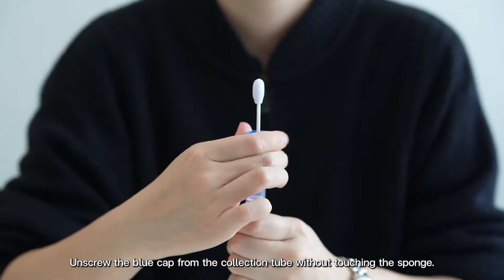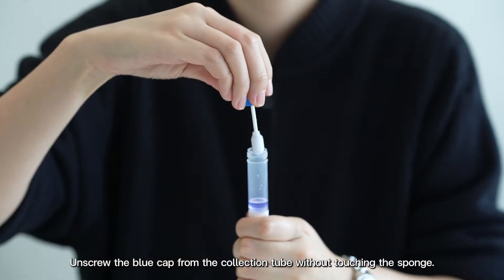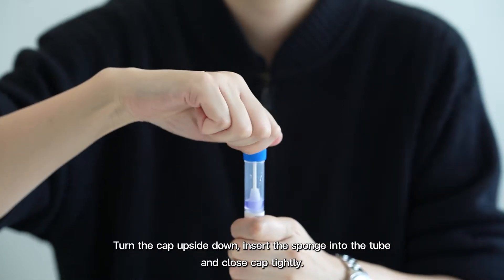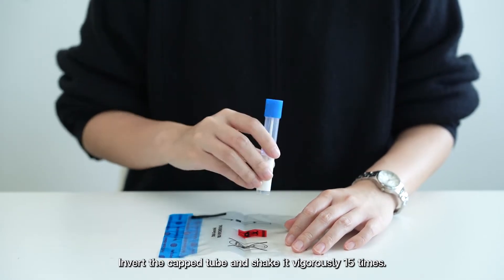Unscrew the blue cap from the collection tube without touching the swab. Turn the cap upside down, insert the swab into the tube, and close the cap tightly. Invert the capped tube and shake rigorously.